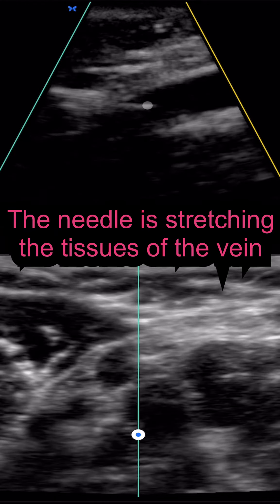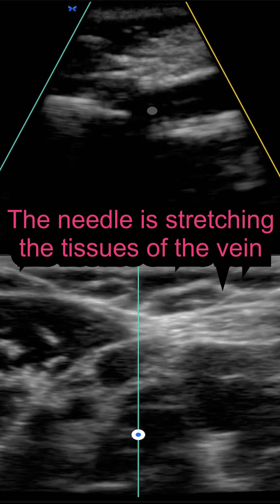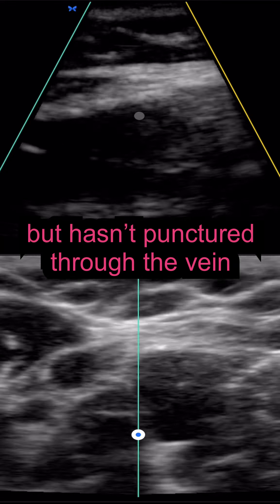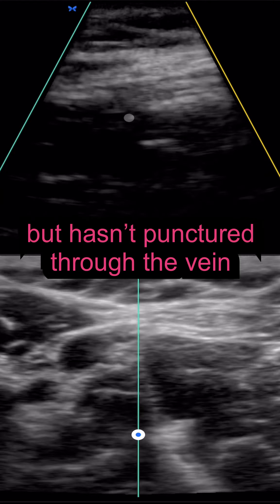So my needle is poking through, but I'm not getting blood returned. The reason being — just like a balloon — the vein is very elastic. So I need to puncture through that balloon. It's like if you try to poke a balloon with a pen.